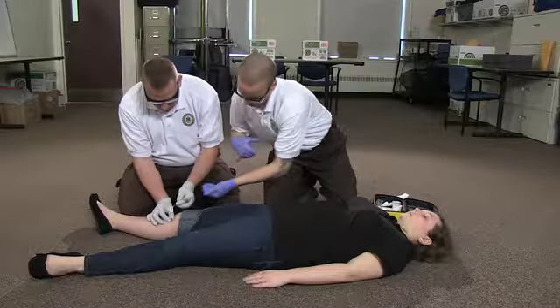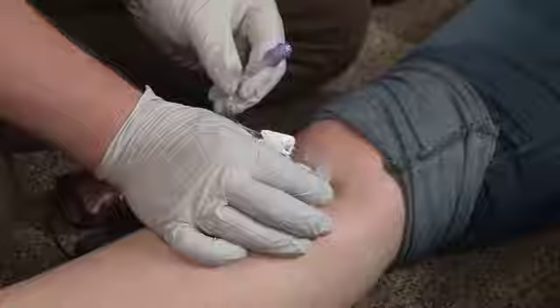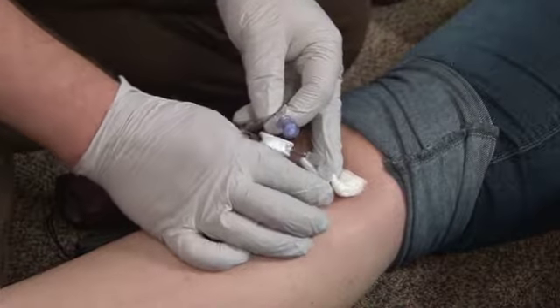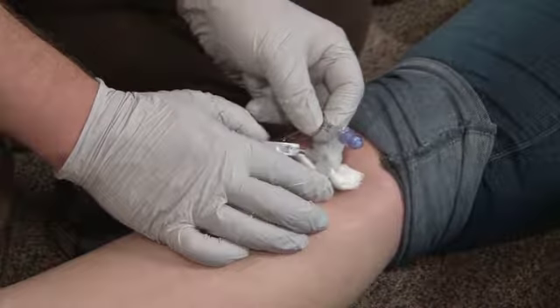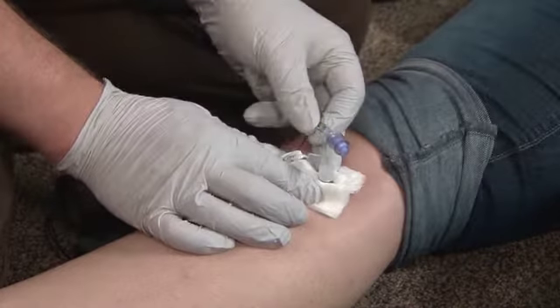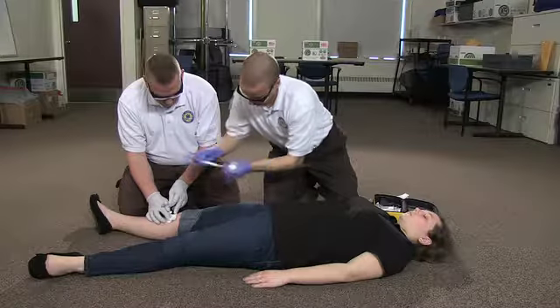If there are no signs of infiltration, the provider removes the syringe from the needle hub, attaches the intravenous tubing, and sets the flow rate. Finally, the intraosseous needle and intravenous tubing are secured.